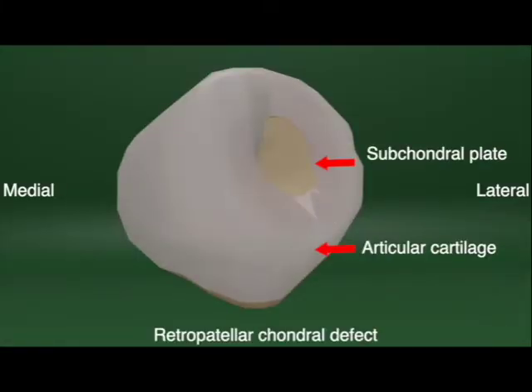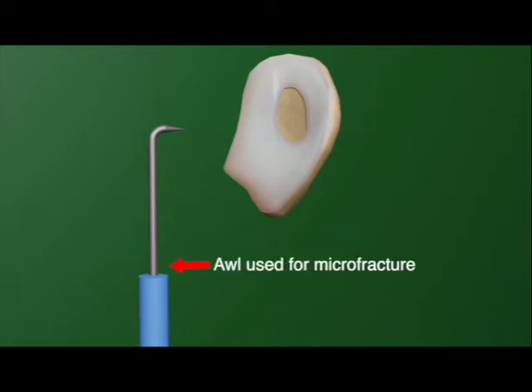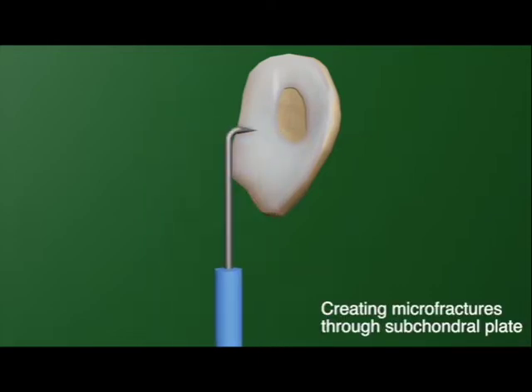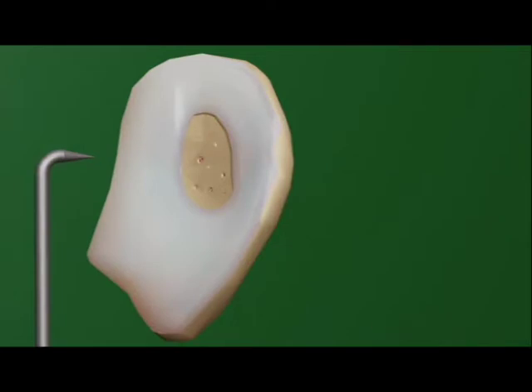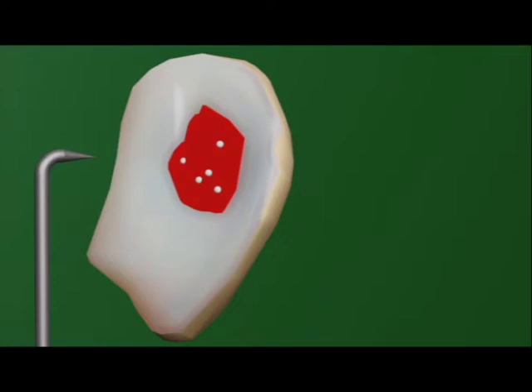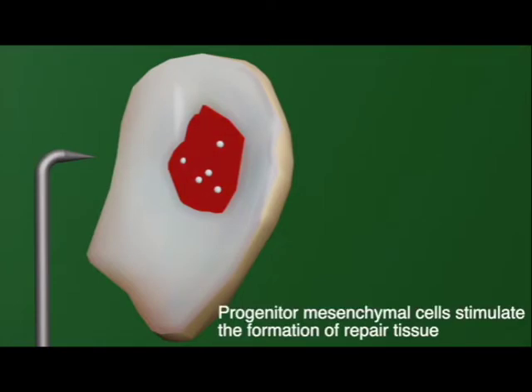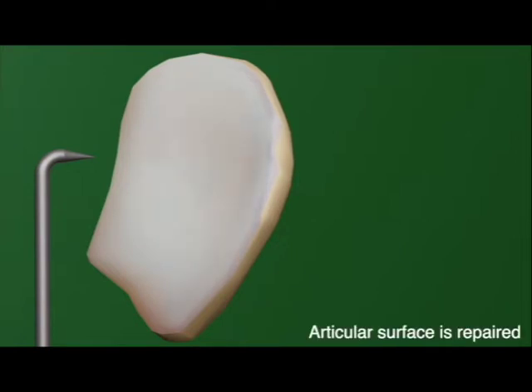We will now be explaining the principles of the new technique. The micro fracturing process relies on creating holes in the subchondral plate of the defect using sharp tools such as an arthroscopic awl or a K wire. These holes form a connection between the defect and the inner bone marrow, leading to bleeding and the leakage of progenitor mesenchymal cells from the bone marrow. These cells remain in the blood clot formed and facilitate the regeneration of fibrocartilage.